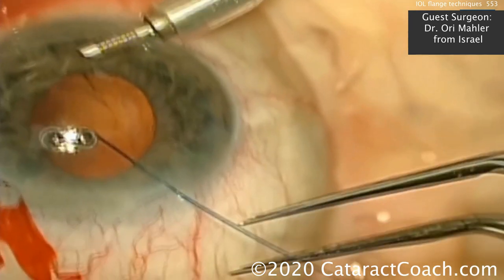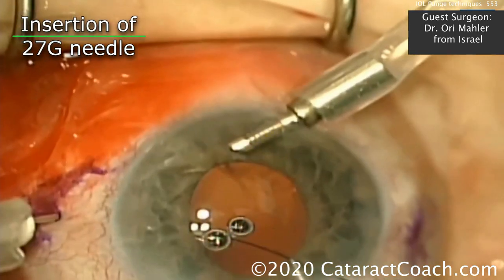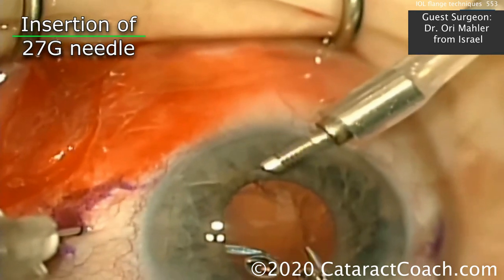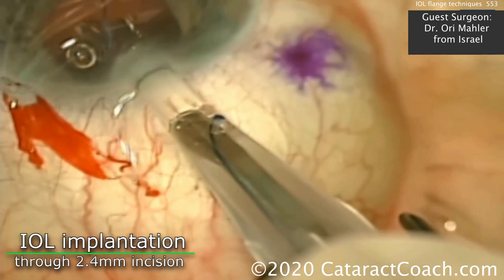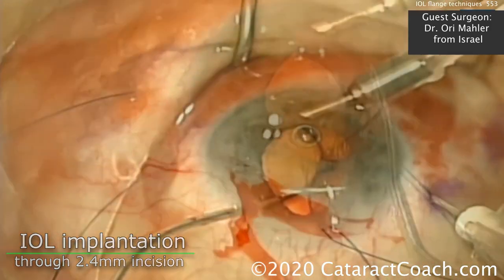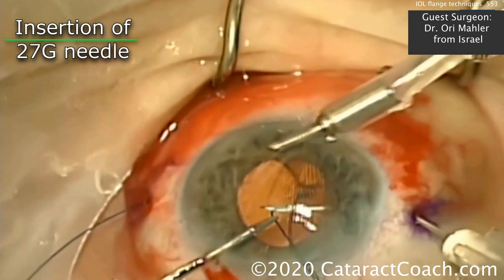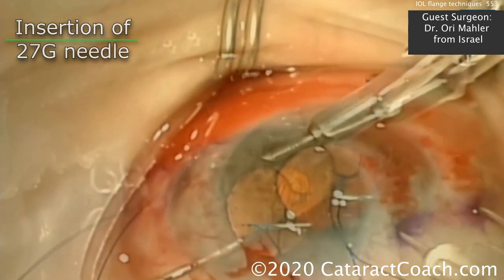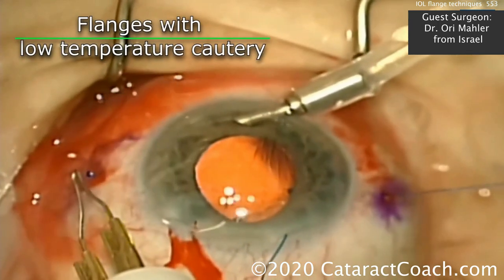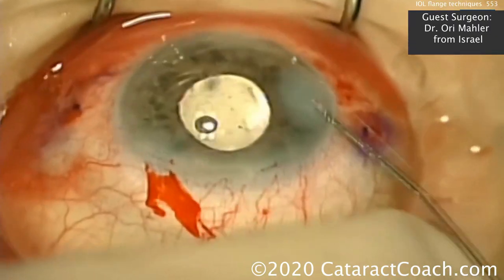Looking good — going down the barrel of the tip. Now bring out the first leading suture, again 2 millimeters back from the limbus. Place the 27-gauge needle and feed this suture material into the bore of that needle; pull it through the sclera and conjunctiva. Here comes the IOL now — goes inside the eye quite nicely. Let that unfold. Now it's time to place the other flanged suture: again 2 millimeters back, placing the needle inside the eye, using forceps to feed the 6-0 prolene inside that needle, then bring it through. You'll now have two sutures, one on either side. The suture ends are pulled through and cautery is applied externally to create external flanges. Those flanges are then buried, and we have a very stable IOL.